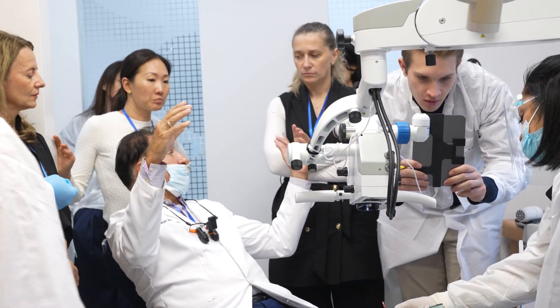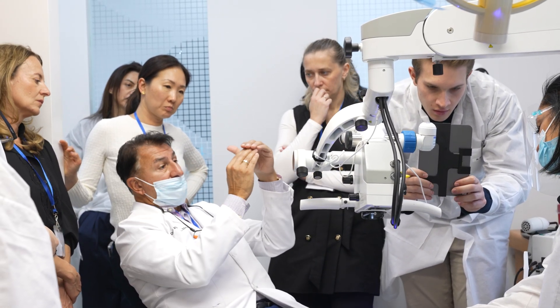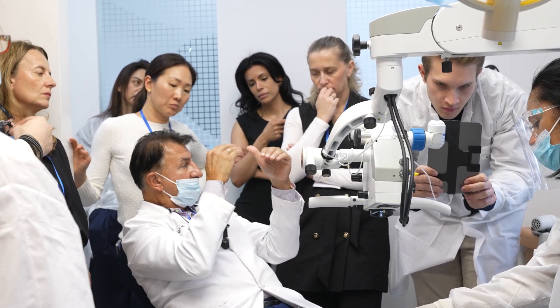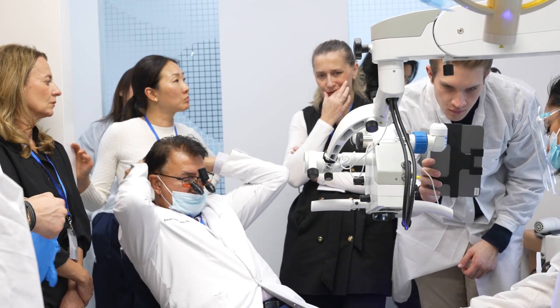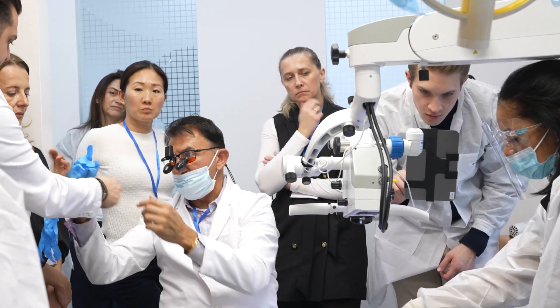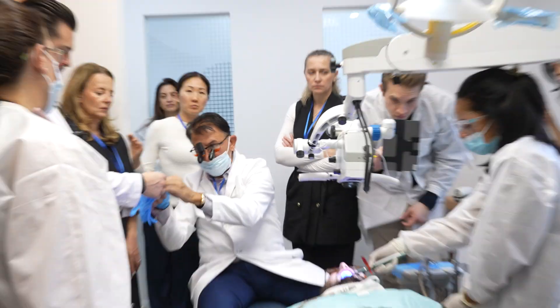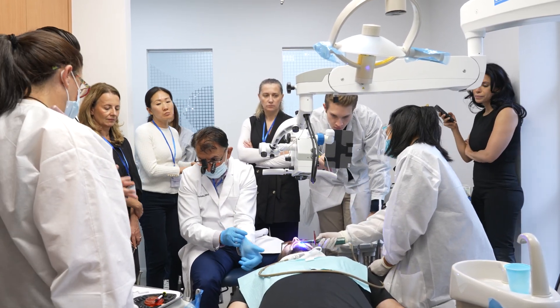This is a disclaimer — this is not sped up. There's a lingual part I've got to check. If there's a little gap on the lingual, I got to fill it up. I put 2FL, fill it up, cure. I got to do every tooth and make sure my linguals are closed. It's already edged — I just got to close it. Sometimes they're perfect and sometimes they're off. So I got to go back and do my linguals. That's when I put my loops on — you just noticed I didn't have my loops on this whole time, but now I want to really see.